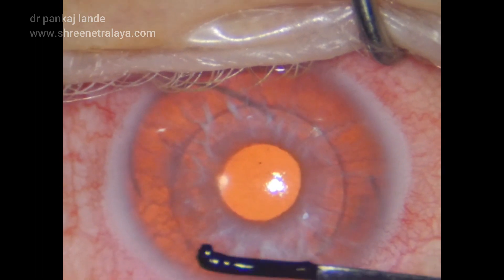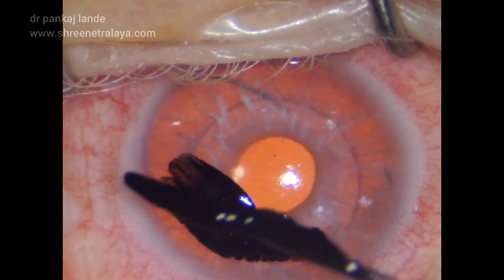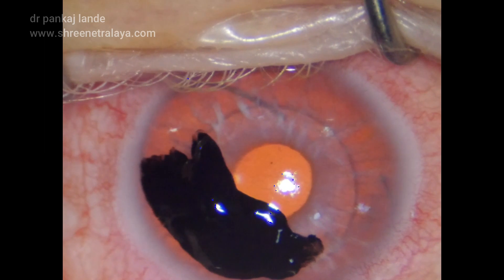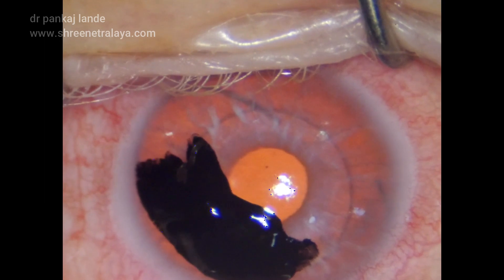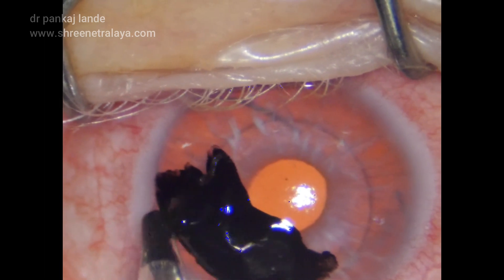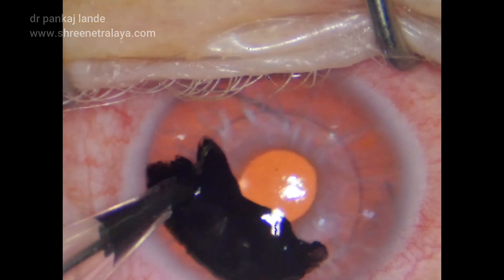I have performed ultrasound pachymetry and OCT pachymetry in this particular case before proceeding for tattooing. I have a preset depth of around 250 microns and I am ready with my ink, which is sterile and autoclaved, to be locally applied with the help of an iris spatula. This is followed by multiple punctures with the tattoo gun.